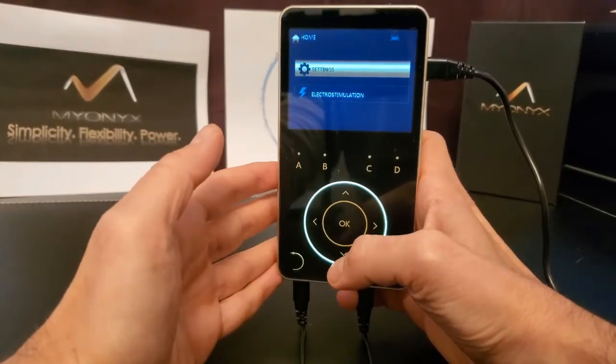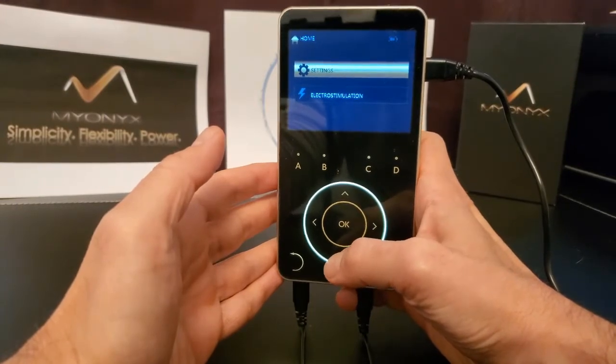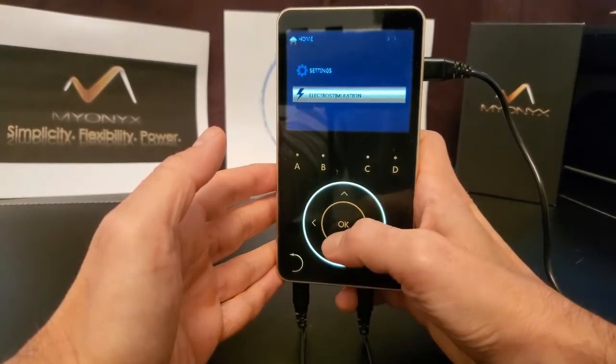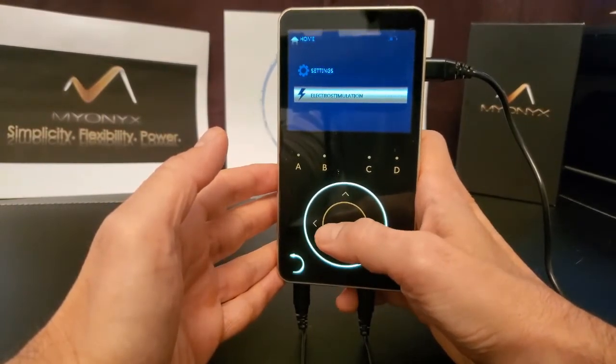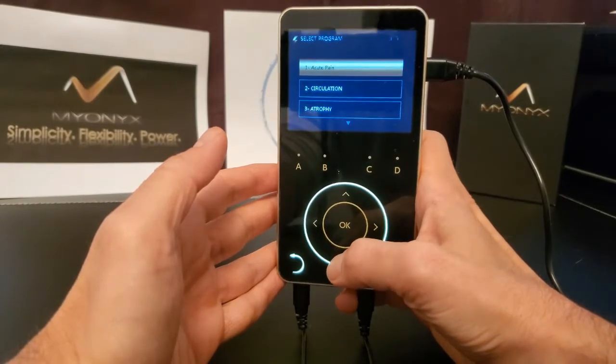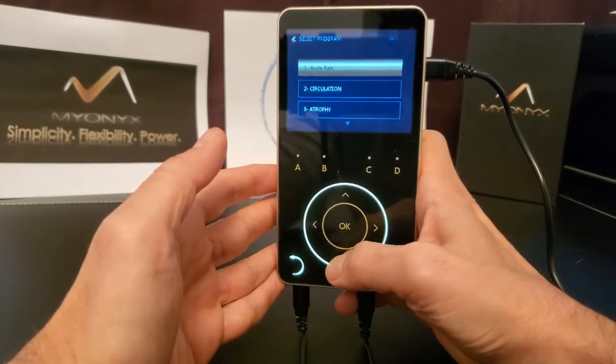From the Home menu, use the up and down arrows to select electrostimulation. From the Programs menu, select the desired program.